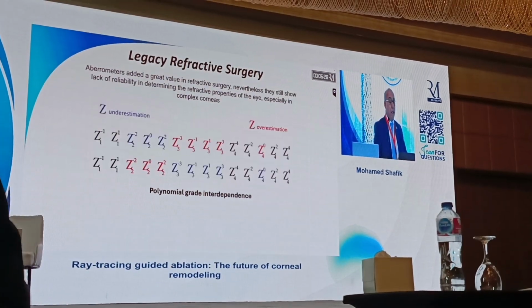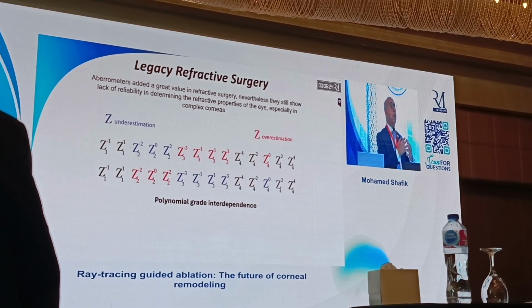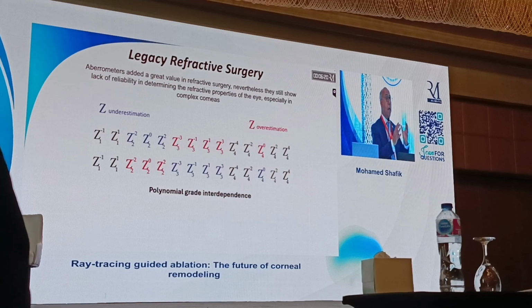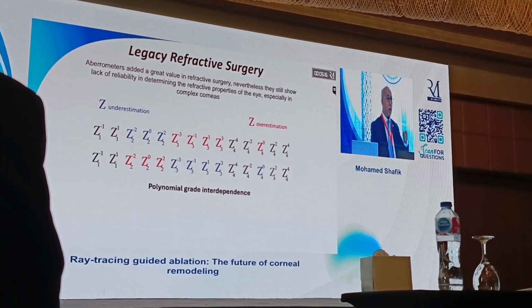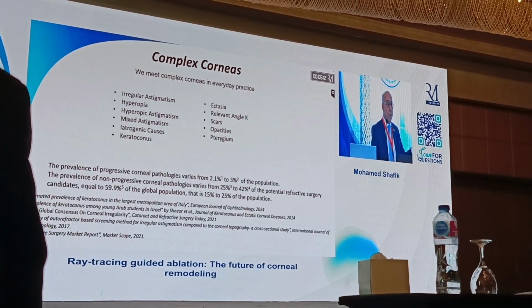aberrometric guided ablation. And of course, the interdependence of the polynomial shapes. Zernike polynomials are shapes to describe the aberrations. All these are pitfalls. Everyone who works with aberrometers or tomography guided ablations knows very well these facts.